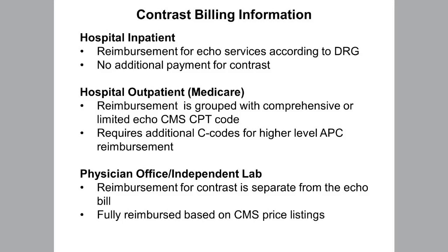What we have found in our institution, and I know a lot of institutions have gone to these prefilled syringes, is that prefilled syringes do not use bacteriostatic saline, and you need that surfactant in the bacteriostatic component to create that nice bubble enhancement. So we have gone back to pharmacy and said, we can't utilize these prefilled syringes. We need the bacteriostatic saline, which they aren't always eager to give up because that's what they tend to use in their compounding. But that's what's worked best for us.